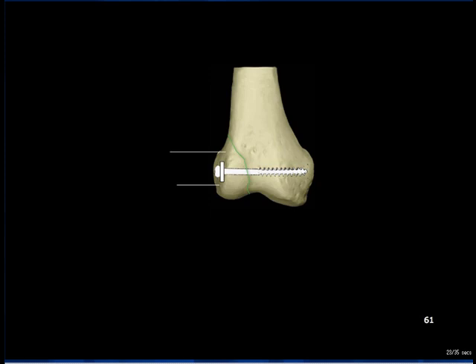Cannulated cancellous screws are available and can be used, a guide wire being inserted instead of one of the Kirschner wires, at the stage of temporary stabilization after reduction.